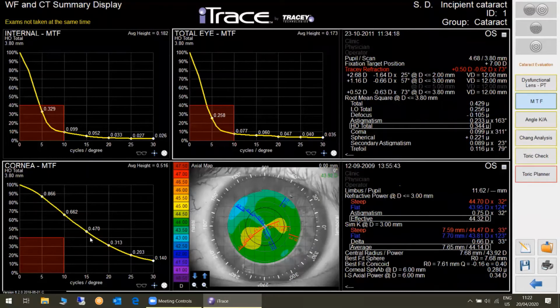So, what about this patient? Well, we see his vision is very, very bad because of the cataract. Okay? But this is going to go away. So I only want to see the cornea. I want to understand if this cornea is premium enough to support a premium IOL.